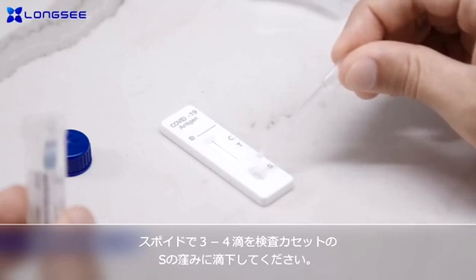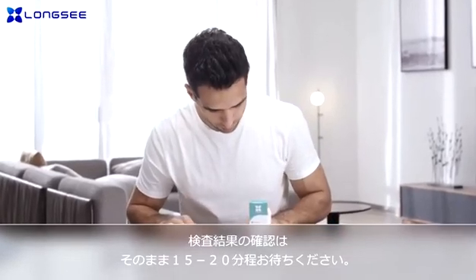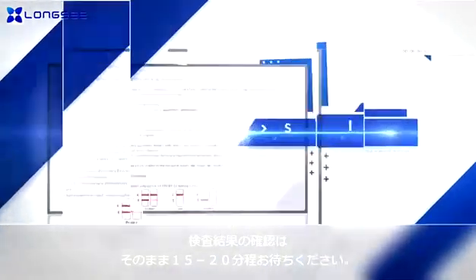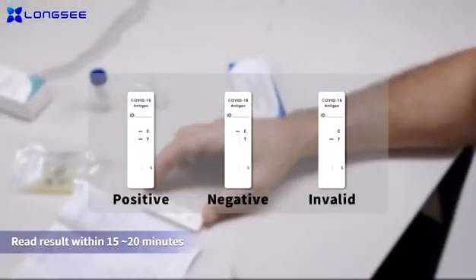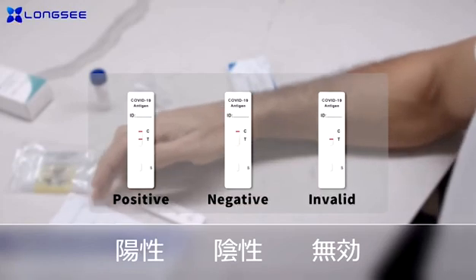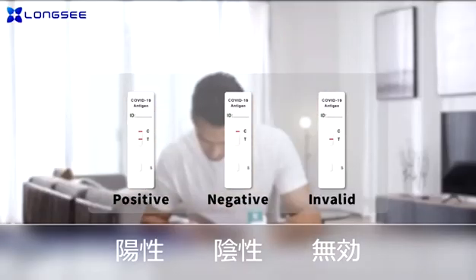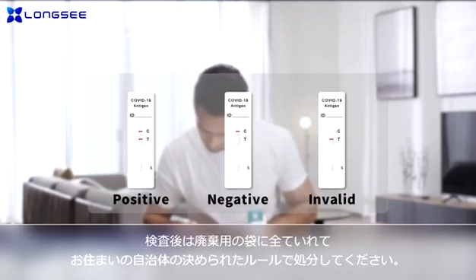Wait for the results. Read the result within 15 to 20 minutes of adding the sample using the illustrations on the instructions. If two lines are visible, the result is positive. One line on the top means negative. One or no line on the bottom means the test is invalid and another test is required.